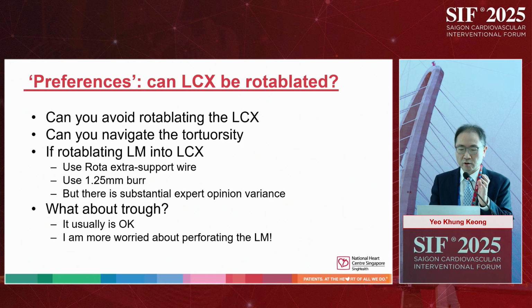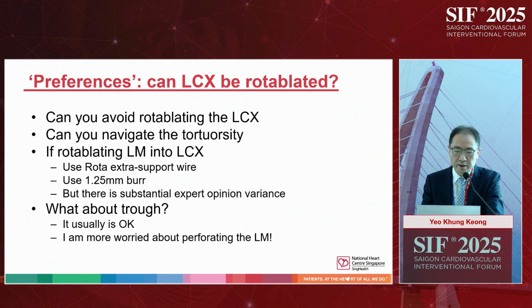Can one navigate the tortuosity of the circumflex? And if rotablating the left main into the circ, I tend to use the RotaWire Extra Support, the smallest burr.